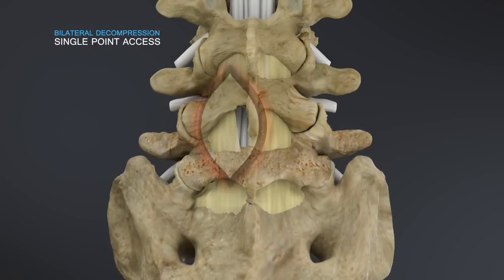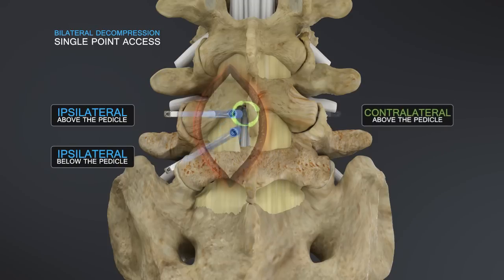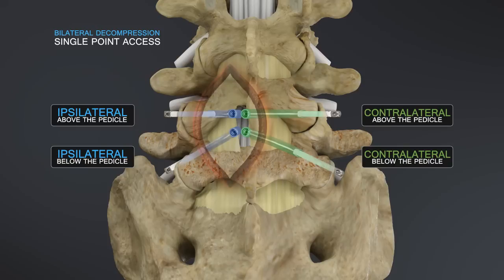The IOFlex system accommodates both open and tube-based approaches and can be used ipsilaterally and contralaterally to decompress up to four nerve roots from a single point incision.